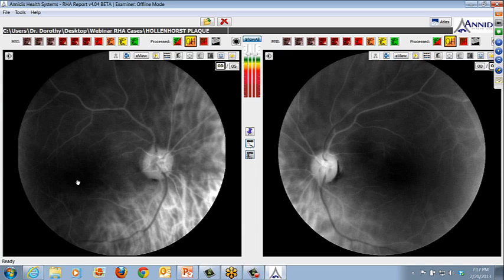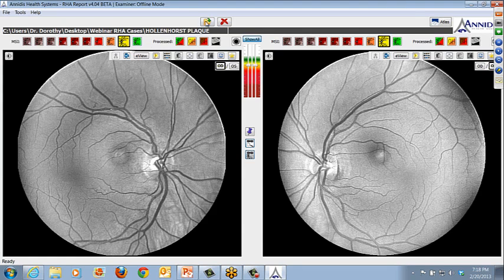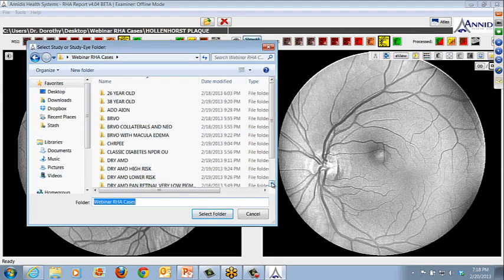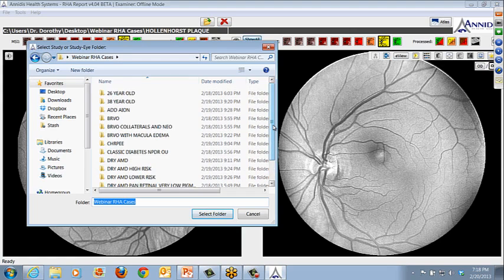So if you're having that difficulty, that will also help you differentiate the plaque type, will change the cardiovascular workup to some degree, and assist your internist in focusing on the patient's appropriate therapy. So just wanted to show that briefly. That's not overly exciting. We see those lots, but just an example of how to differentiate and how different tissues are hyperreflective with the different LEDs depending on location.